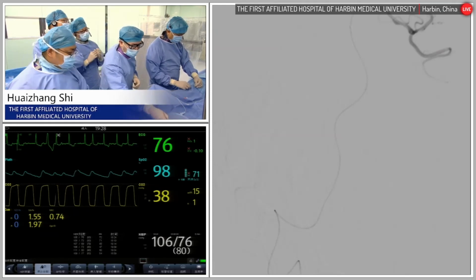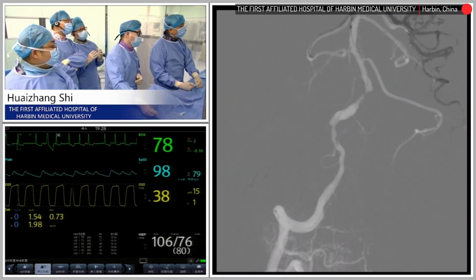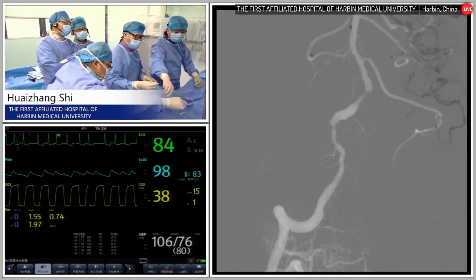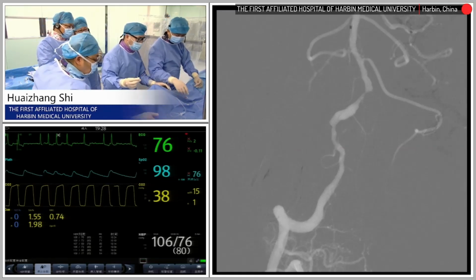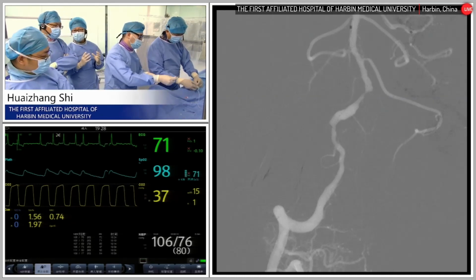Dr. Wu, it's kind of controversial whether or not to treat intracranial vessel or intracranial stenosis with the interventional approach. So far, there are no studies confirming the efficacy of this interventional management. So what's your thought on this? At least what's the indication for this patient?